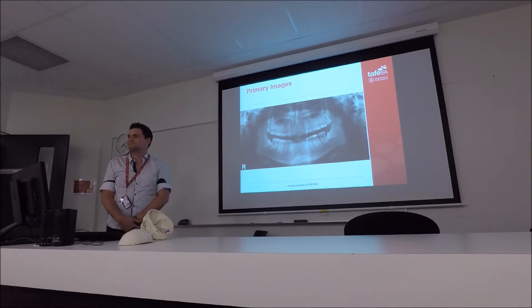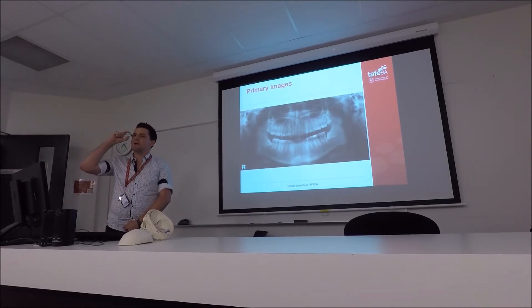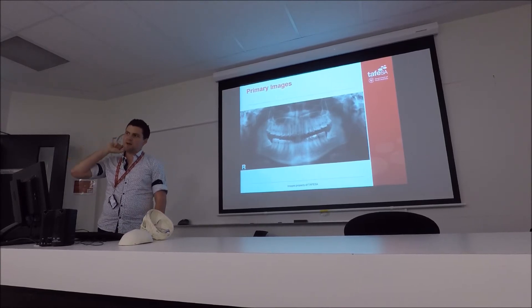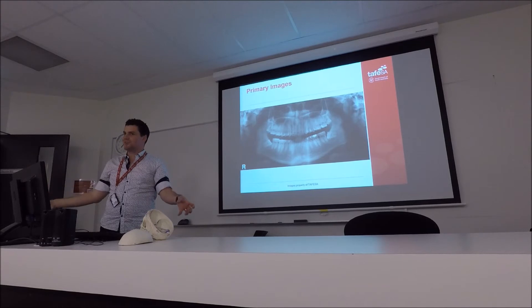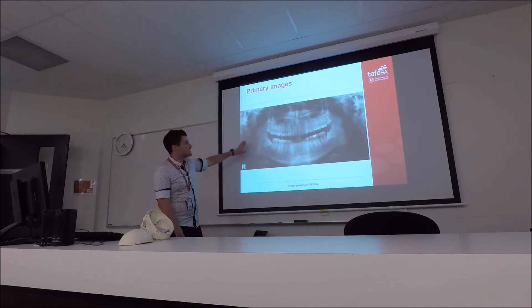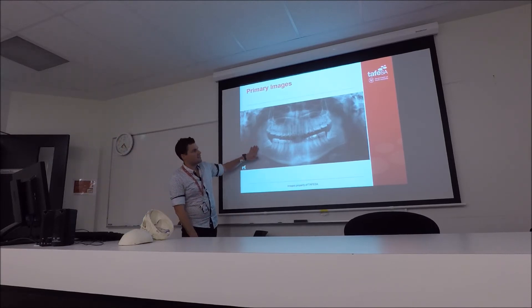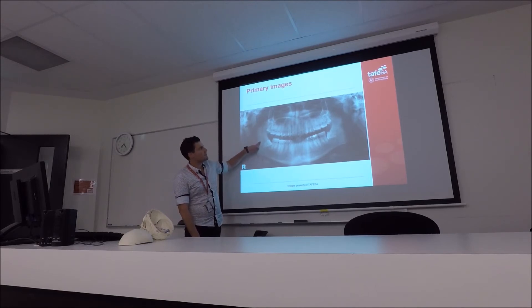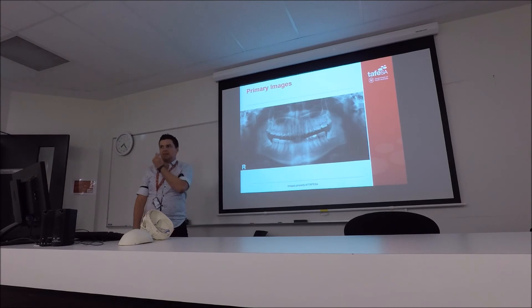It's a tube. It's air. So what you have is at the back of your mouth you've got what we call your pharynx, which is a tube that runs down the back. Can you see how that's been divided into two? Because it's a double primary image and that's sitting at the back of your mouth. What kind of defines that is you have your back of your tongue, which has gone a faint white colour, but because the tongue's nicely pressed on the palate, we've got a nice clear image.